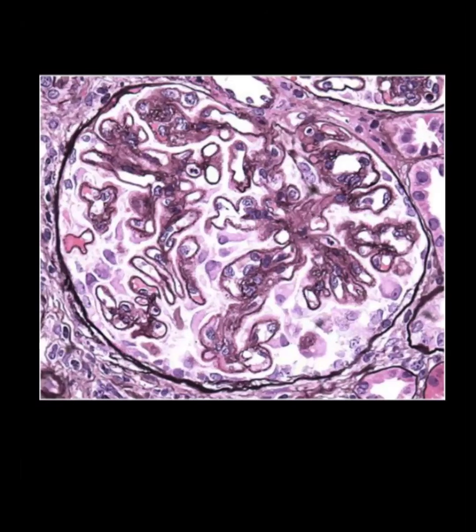Silver stain, silver methenamine. What is it showing? Rounded glomeruli. It shows spikes. Yes, it is showing the thickened basement membrane with spikes. So again, this is membranous nephropathy.